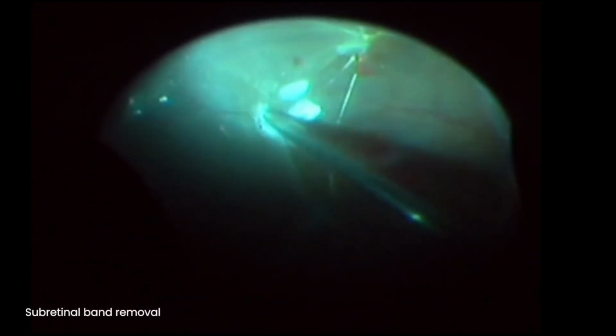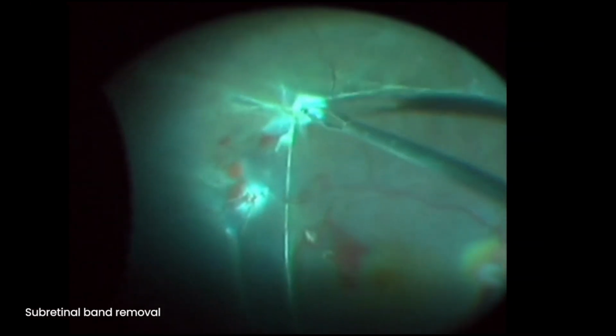In the cases of CRD with subretinal bands close to the macula, the subretinal bands have to be removed after total membrane dissection, taking care not to inadvertently damage the macula. Perfluorocarbon can also be used judiciously to stabilize the posterior pole after tackling the preretinal membranes.